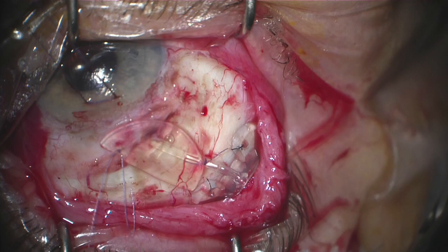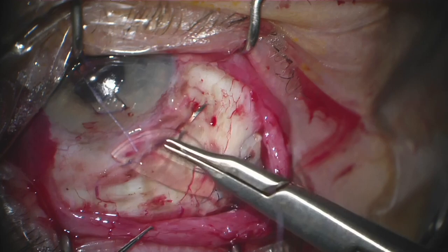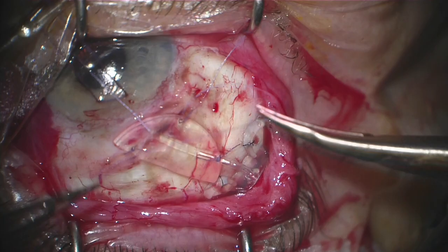A corneal patch graft is then sutured in place over the tubing, and this is to prevent erosion of the tube down the road. I do like to tunnel my tubes closer to 12 o'clock, as I find that you get better coverage with the upper eyelid and again a lower likelihood that the tube is going to erode in the future.